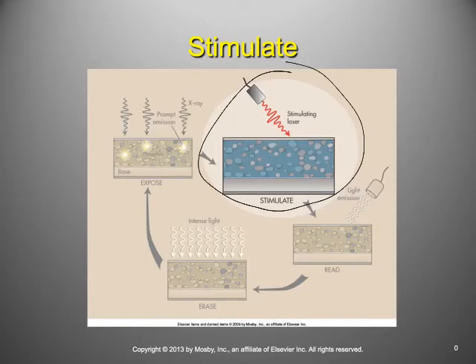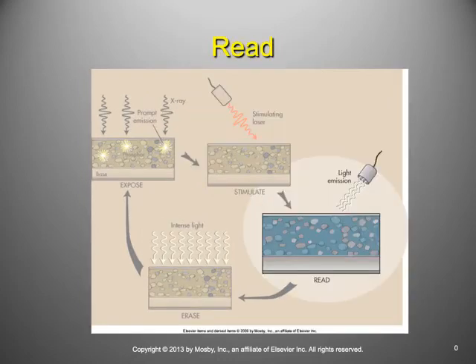Okay? When it scans over the photostimulable phosphors with the laser, they're going to emit light. So the metastable electrons will return to the atoms, and in that process they will emit light. Now the light is going to be in like the blue, green, indigo spectrum, right? So let's talk a little bit about that. In terms of wavelength, right?